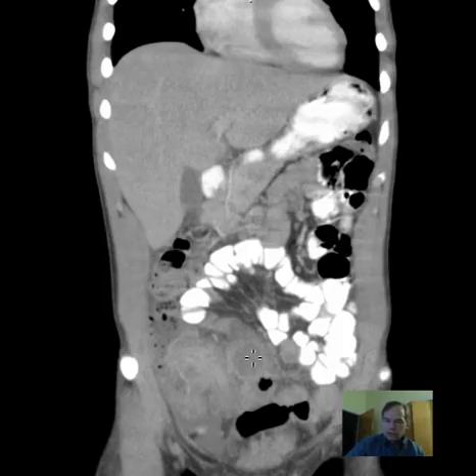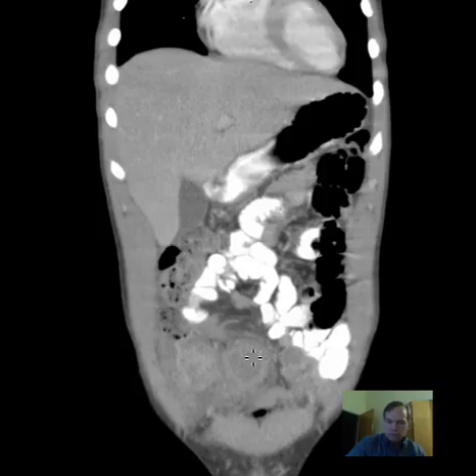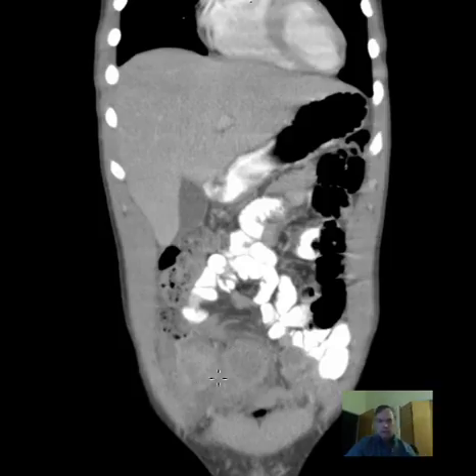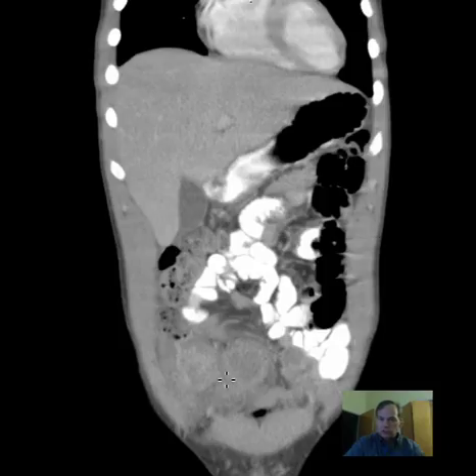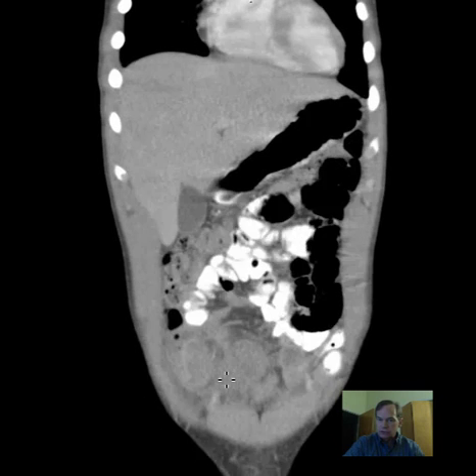In addition, there are a couple of fluid collections — one here and one here. This could represent abscess formation or fistula communicating from the inflammatory changes in the bowel to adjacent tissues.